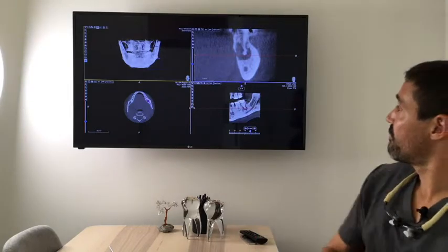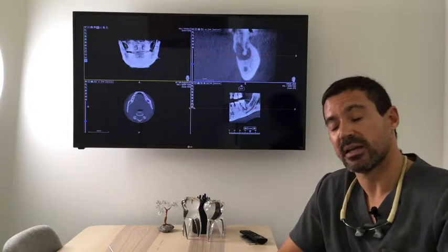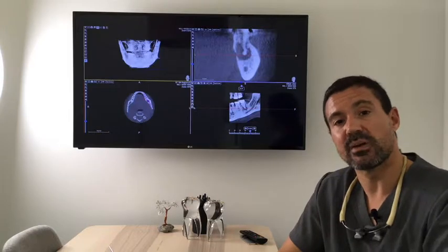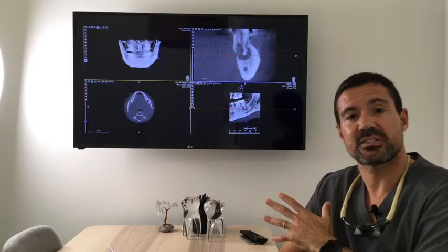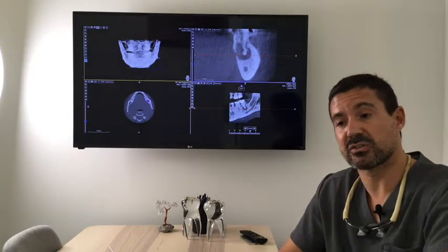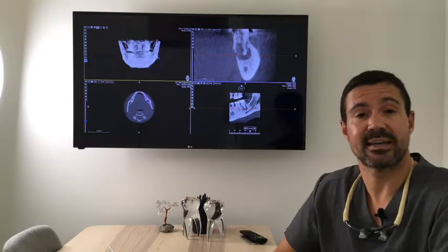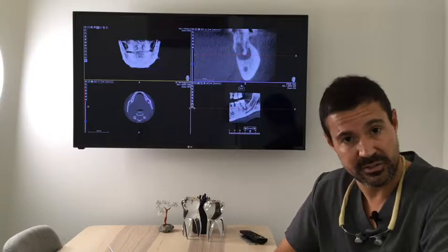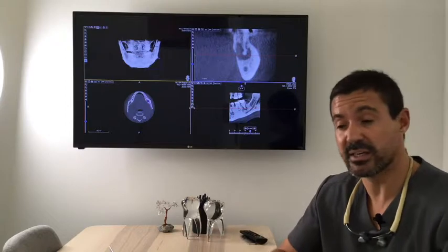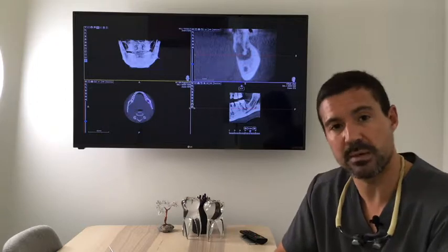Well, in this case, just to finish the presentation of this online class, I will leave you with a video of how we treated this case in terms of the materials that we actually used. We did the socket preservation first because we couldn't place the implant the same day of the extraction. First, because when you have converged roots, there is no remnant bone that you can anchor your implant in. Second, when you have a lot of cyst and a lot of extension of your cyst, you actually remove a lot of bone, you're not going to find too much bone, and that will compromise the appropriate implant placement.